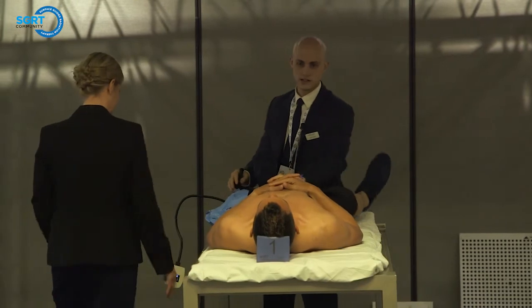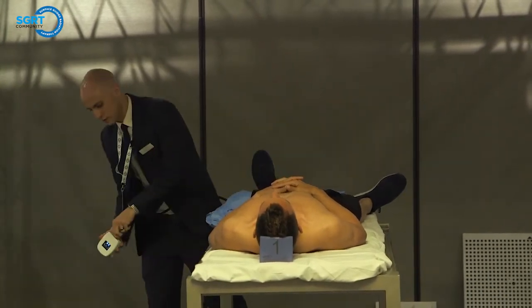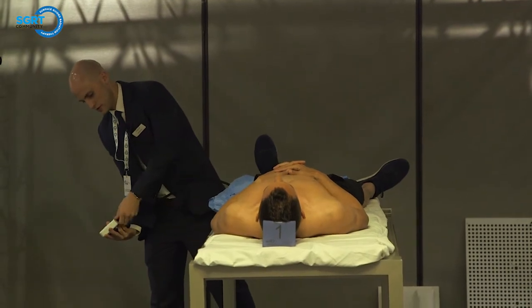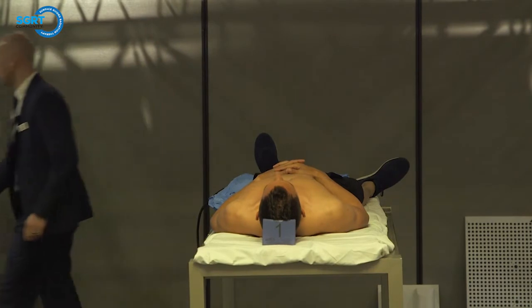Okay, you can just relax your knee down all the way. Okay, well, this will be a good experience for everyone. I guess I'll take this off so I don't break it here. Put this down out of the way.